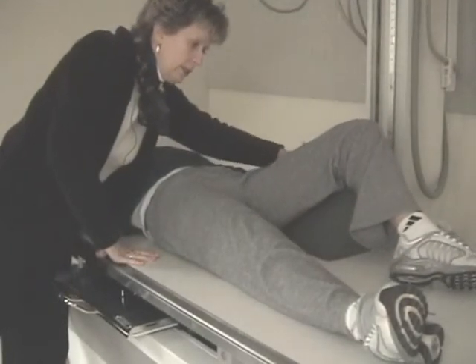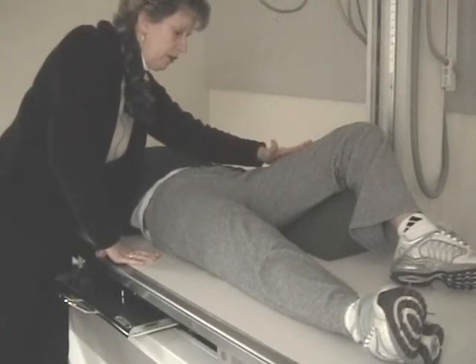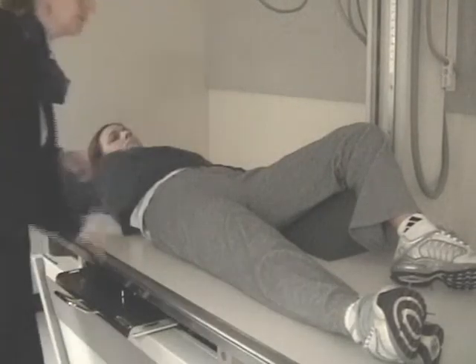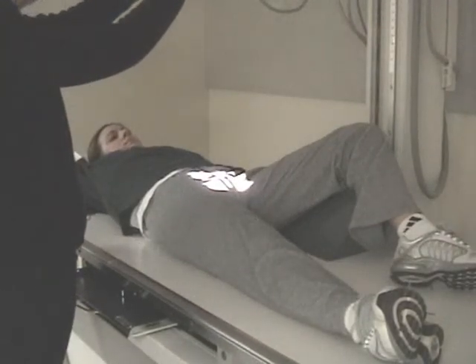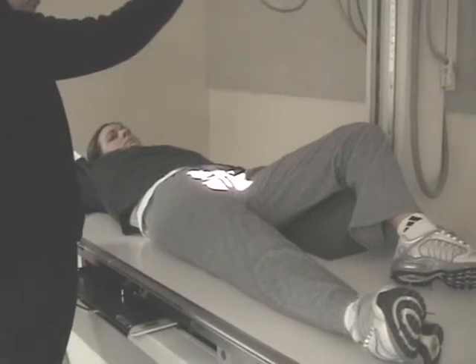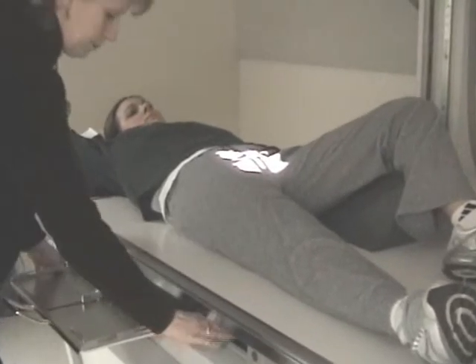I think you can see the sponge there. Your leg is at 45, that would be 90, halfway is 45. Okay. You're going to collimate down tight. I actually have like 7x7, which will show approximately 1 inch of collimation all the way around. It's lined up to the center of the cassette.